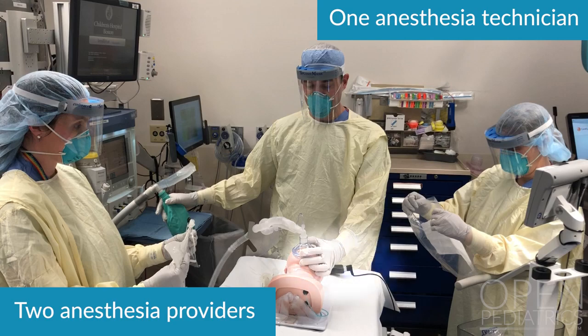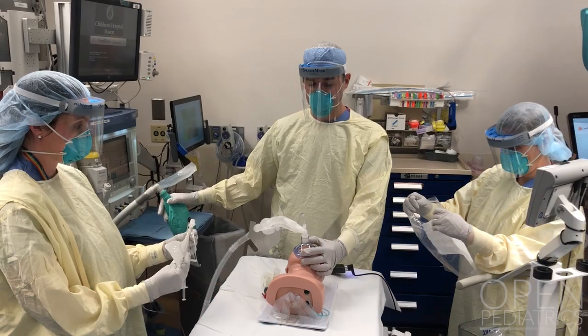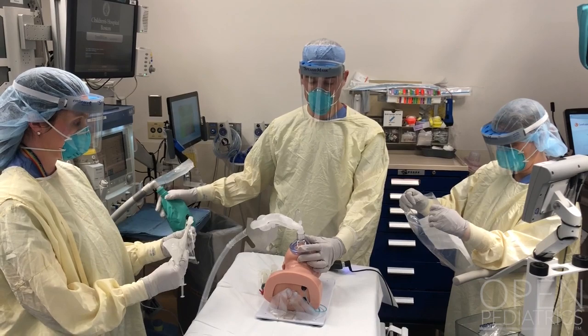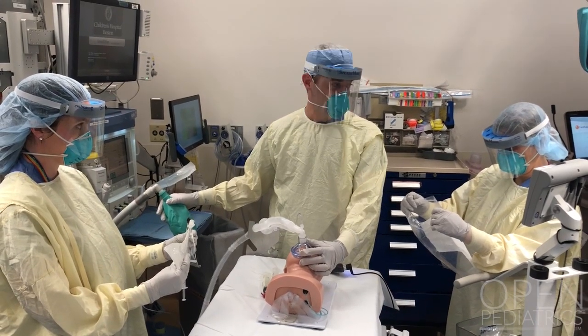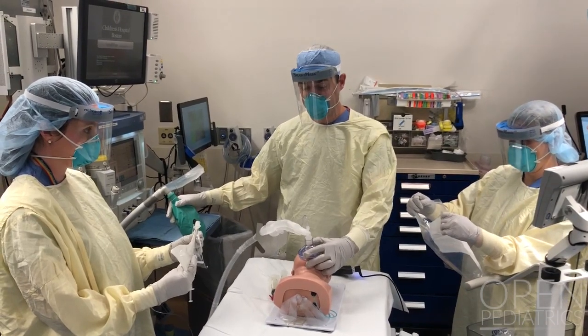Notice the video laryngoscope on the right side of your screen and the anesthesia tech holding open a sealable zip-lock bag ready for any airway equipment that is dirty to be discarded. Communication with the team is essential, and when you're ready to begin the intubation, you should turn off the fresh gas flow.